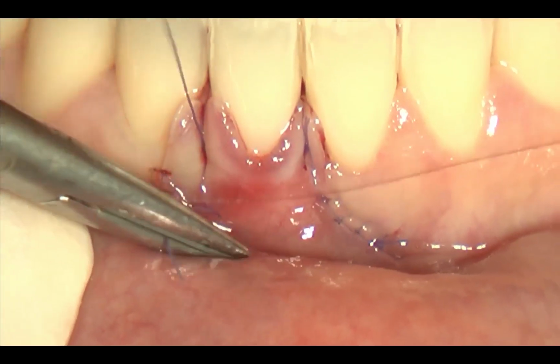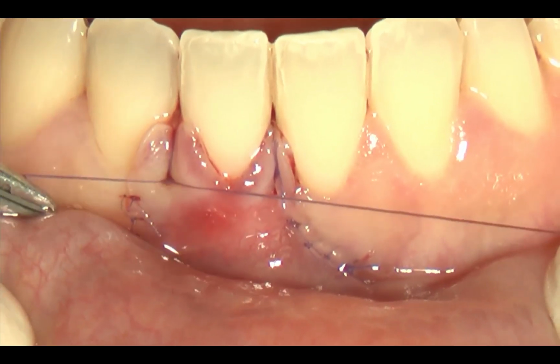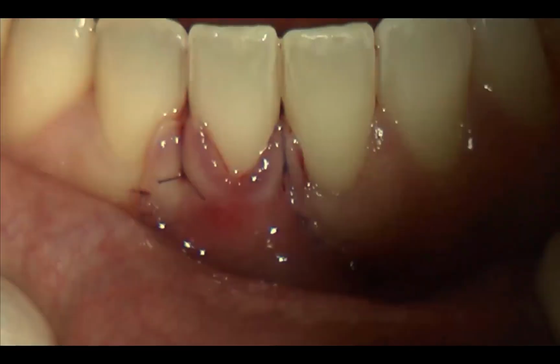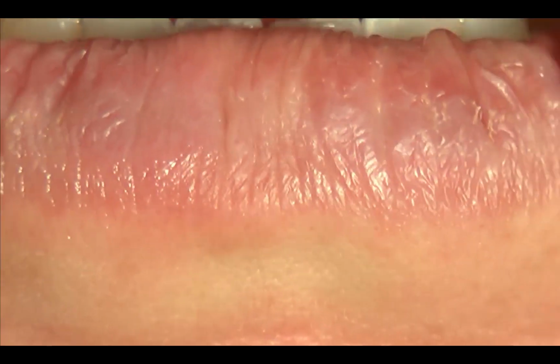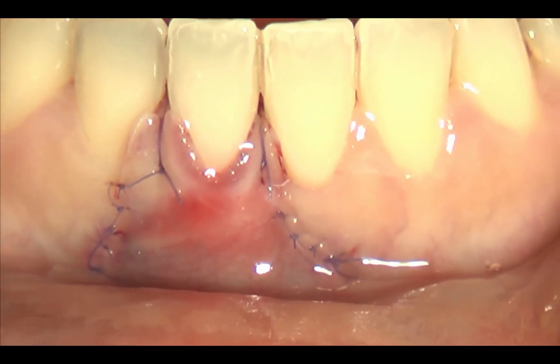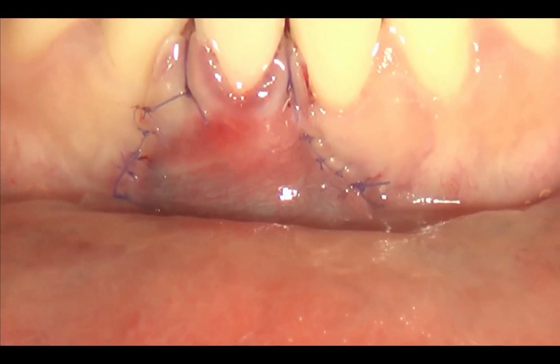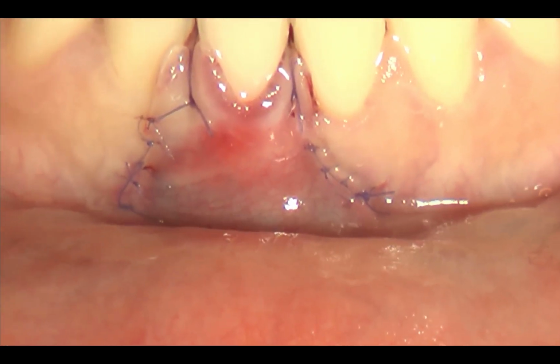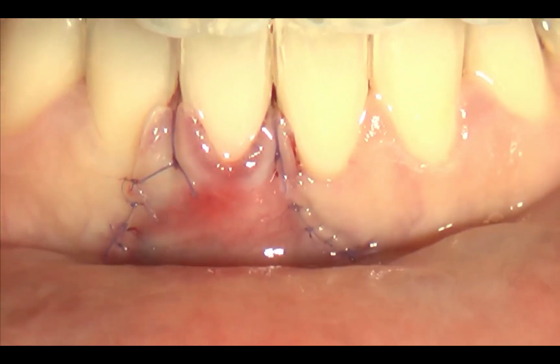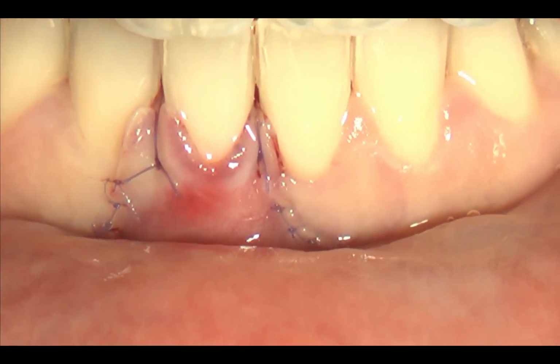Now, once stability has been achieved, I close the knot. Now you have to stay here, with the lip in tension, and you have to check that there is no more bleeding getting out from the soft tissue margin. When I pull the lip, there is no bleeding escaping from the soft tissue margin.